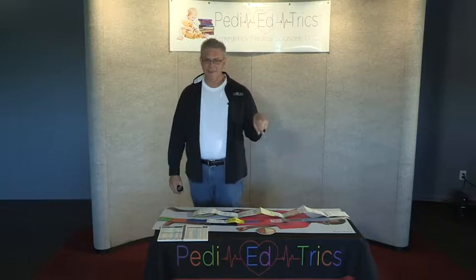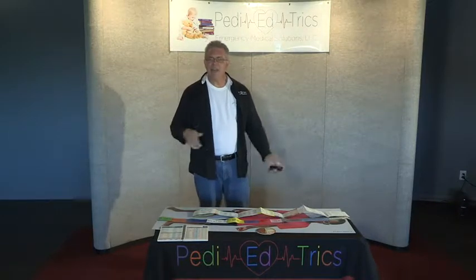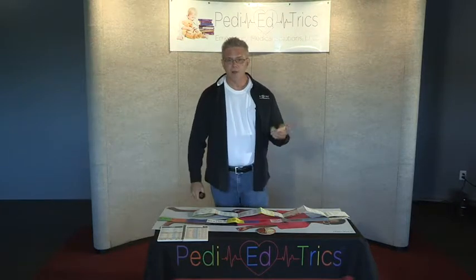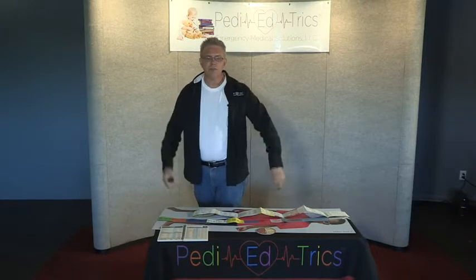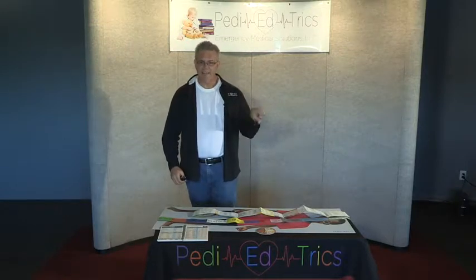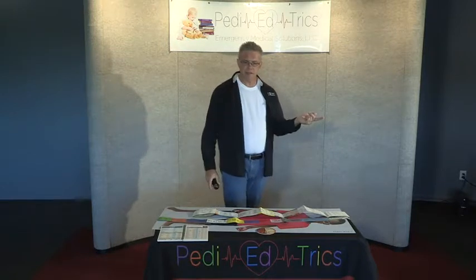That's important, because they only make evens. Meaning, if you can't find an 11, what you can find is a 10 or a 12, and either of which in a pinch would work just fine. And whatever you've got for an endo tube that's in place, tube and tape and 3 all begin with T, cluing you in that 3 times is where you tape it.